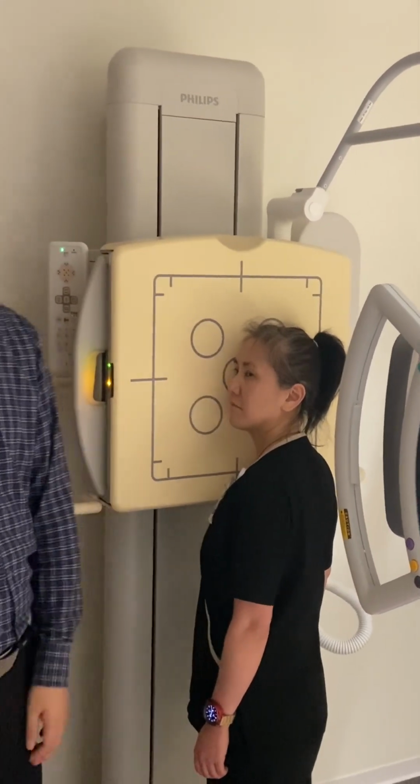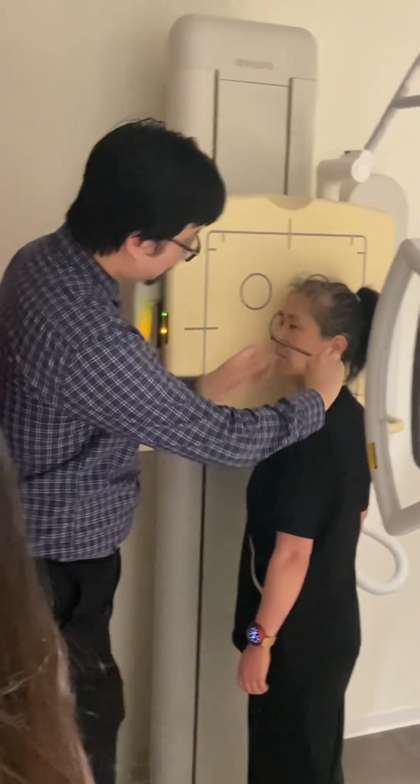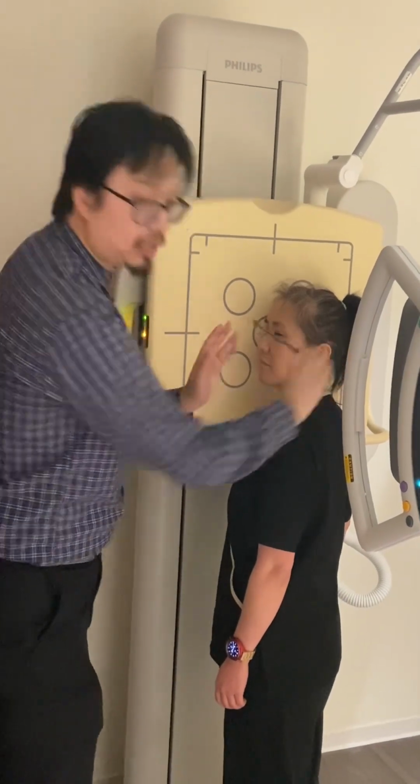So, the three things we are looking for. Number one, IOML needs to be flat. It should be perpendicular to the front of your IR. So we need this IOML flat.